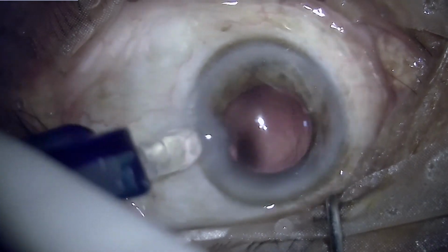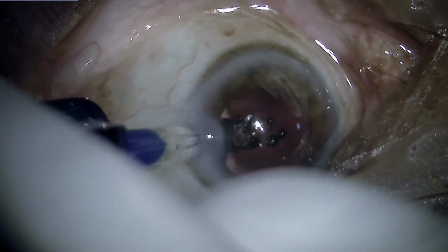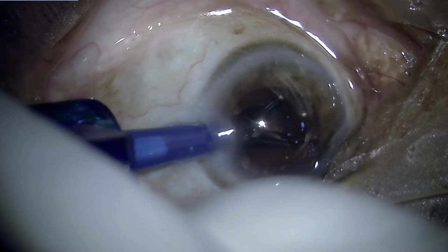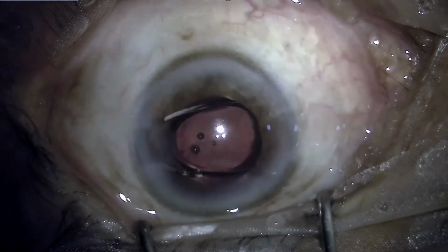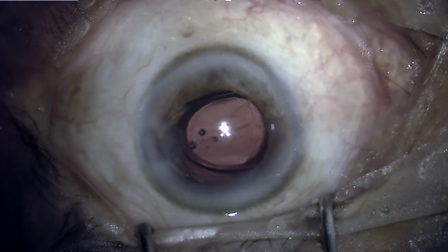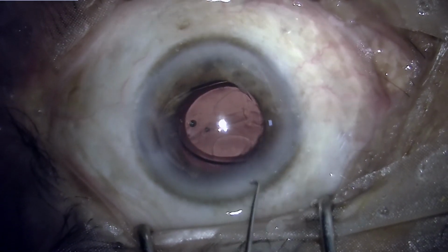Now implanting a single piece hydrophobic monofocal intraocular lens in the bag. The trailing haptic has not gone into the bag, so it will be dialed into position.